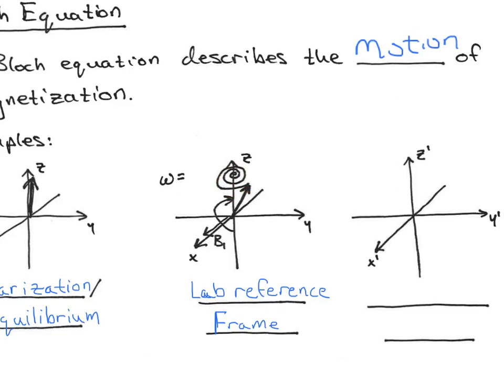So then the frequency of precession is gamma times B0, right? And in this frame, often the RF, if you're playing out RF from a quadrature source, will also be rotating at 128 megahertz, or it will at least be oscillating. If you have a surface coil, with a linear polarization, it'll be oscillating along the x-axis here at 128 megahertz.